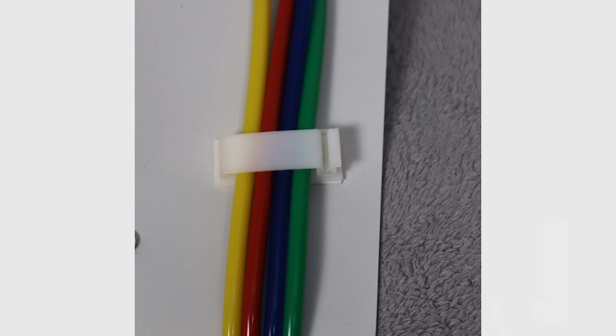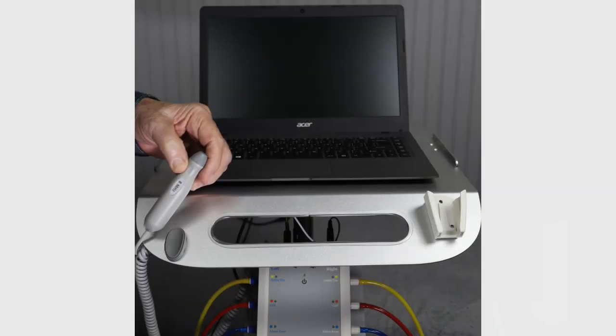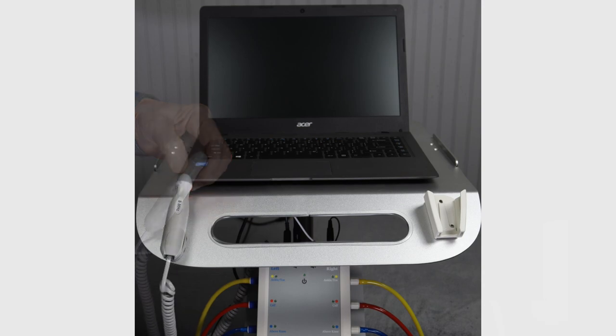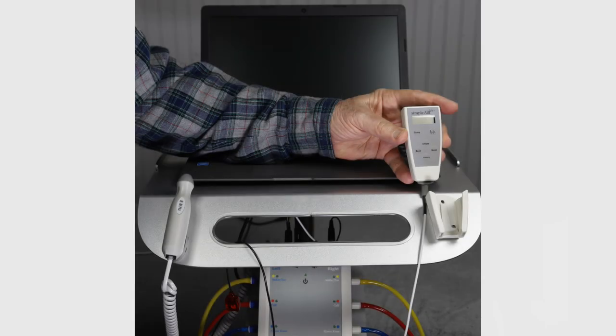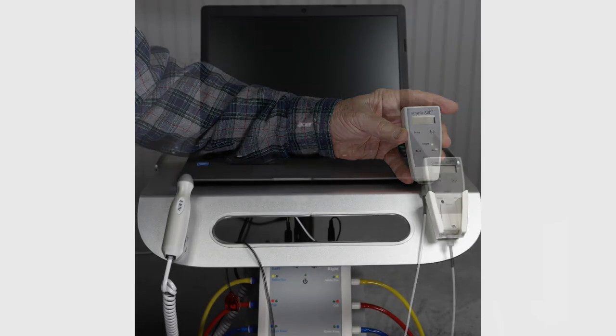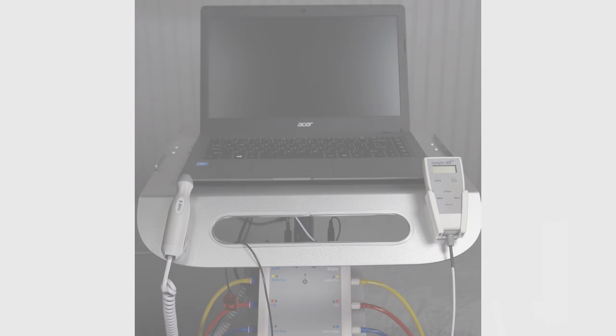This step gives stress relief to the connector ports on the cufflink. Place the Doppler probe in the magnetized holder. Hang the PPG probe inside and over the handle. Place the remote into the remote caddy.